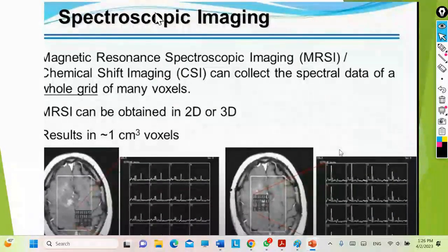From my experience, this is used normally, not to the extent that it will affect him, but how many Teslas do I have? It's not 1.5. It is used normally, meaning it won't have that much of an impact.